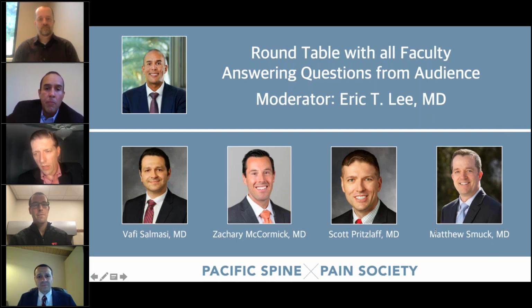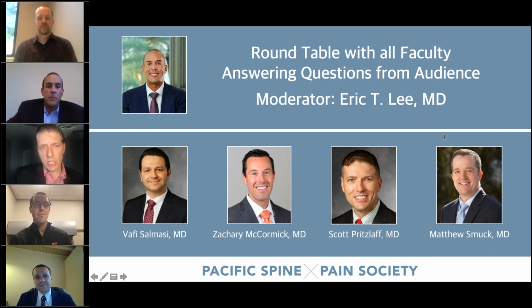Yeah, so I'll comment on that, and then I'll have Zach, if he knows of any. I know there's a smaller Indian study a couple of years back that looked at monopolar versus bipolar lesion, and I think the big thing that they found in that study was patient comfort during the ablation, but there wasn't a significant change in relief post-procedure. I don't know, Zach, if you know of any other studies out there. I don't.